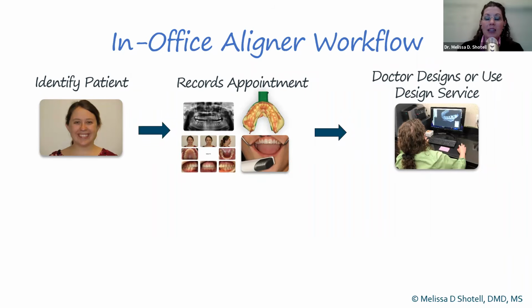I myself personally like to set up all of my own aligner cases. I describe this to my patients as playing high-tech Tetris. I realize now that I'm a little bit older than I was when I started using that analogy, because years ago, many of my patients knew what Tetris was. Today, I'm afraid to say that only about half of my patients know what Tetris is. But for me, this is sitting down at the end of the day at my computer and seeing how we can fit all of the teeth together.